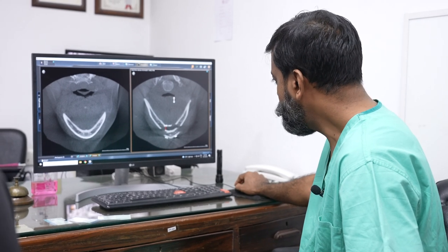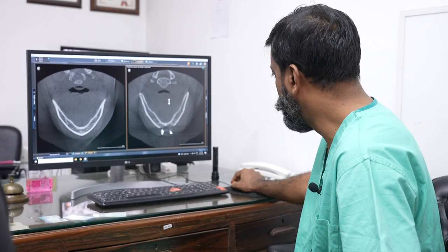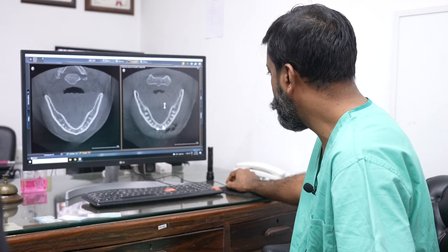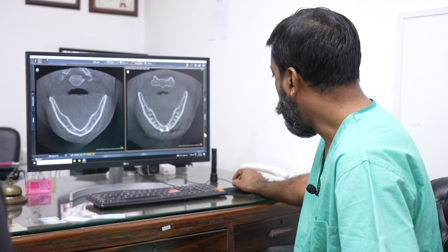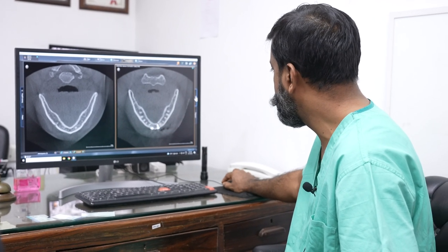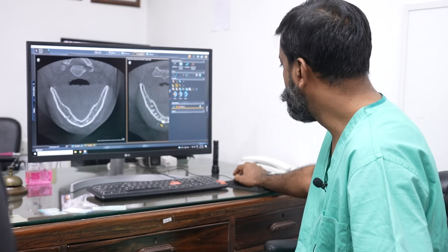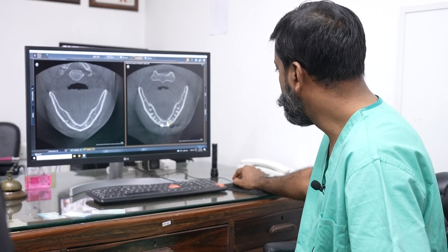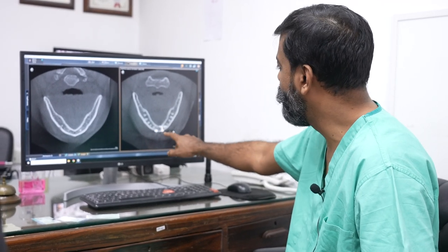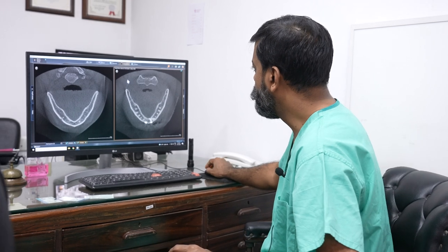These measurements are very precise — not even 10% error. Exactly what we planned, we've achieved. I can also show you the length of the screw. You see it's almost engaging the second cortex — that's 8mm, so we use 8mm screws and it shows 8.4. So we've got 9mm of advancement.